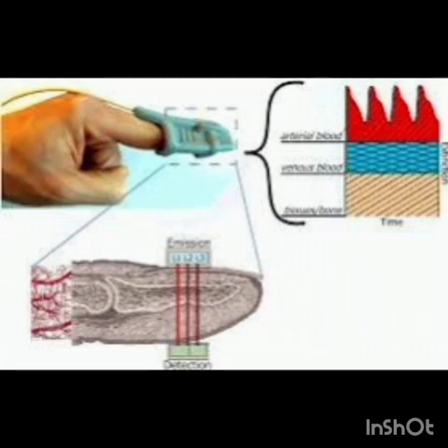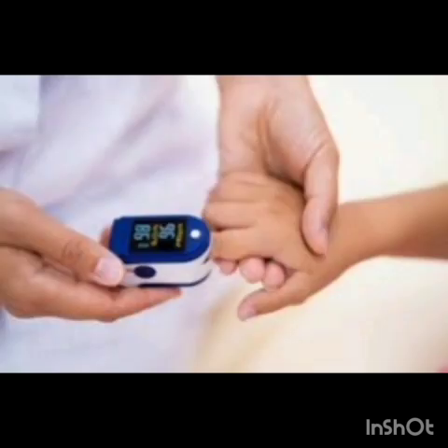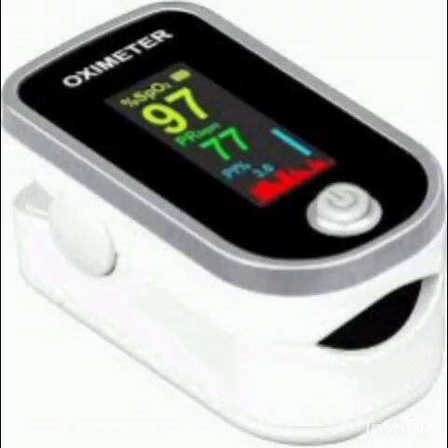Then the advantages of the pulse oximeter. The advantages are rapid response, non-invasiveness and accuracy, including in the intensive care unit, operating theatre and recovery rooms. Then emergency and casualty use.